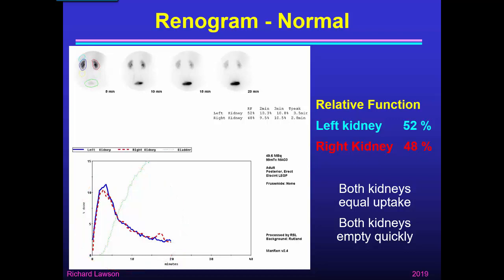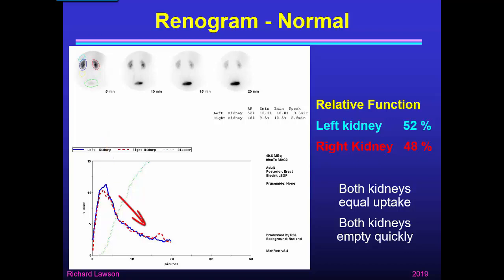We can see that the left and right kidneys rise at the same rate in the first few minutes, showing that uptake and function in both kidneys is about the same. The computer calculates the left kidney function at 52% of the patient's total renal function and the right kidney at 48%. Both kidneys reach a peak at about four minutes and thereafter begin to empty, showing that both kidneys empty normally in this case. This is the sort of result we're aiming to produce by our renogram analysis.